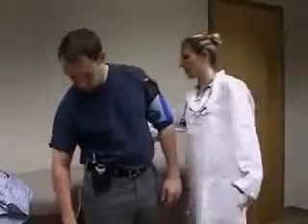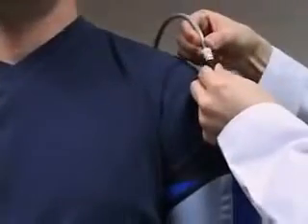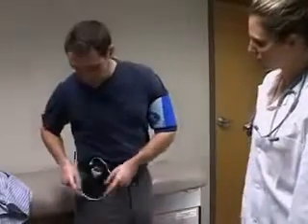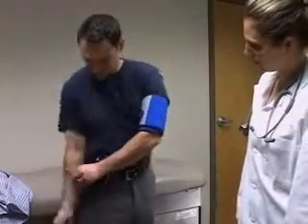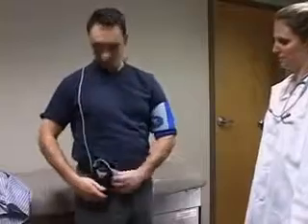Next, connect the air hose from the Oscar II to the cuff. A proper connection is made by twisting the connectors in place and hearing a click securing the hoses together. If there is slack in the hose, adjust it so the patient is comfortable. Make sure the hose is not kinked or folded to avoid blocking inflation of the cuff.